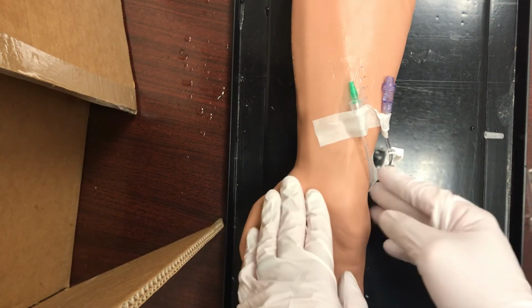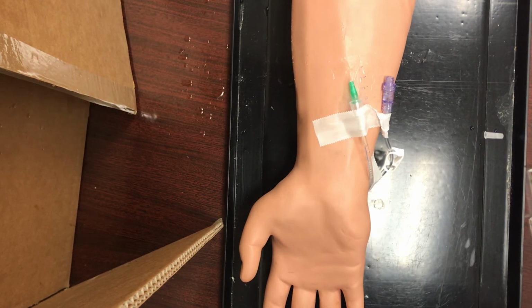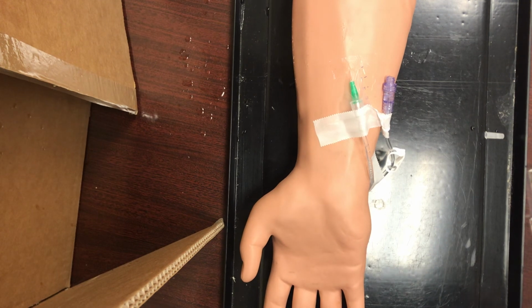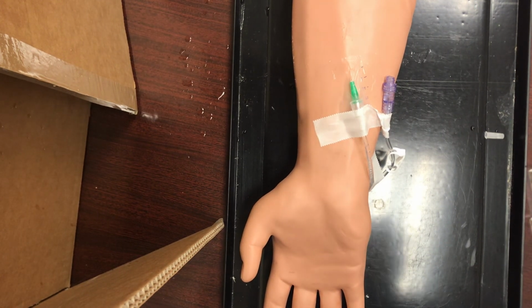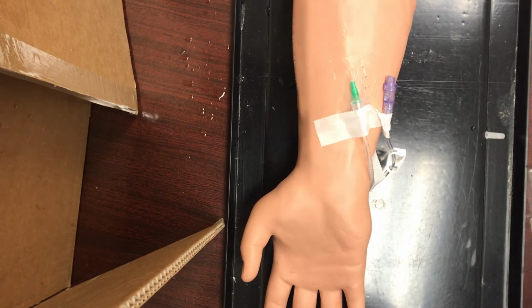But now that you've administered the medication, you want to document all of your findings, your administration, and then reassess the patient as appropriate. This concludes the video for IV push medication through a peripheral line. Hope you enjoyed.